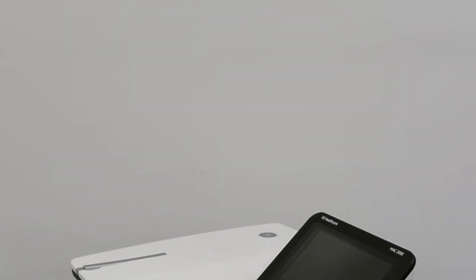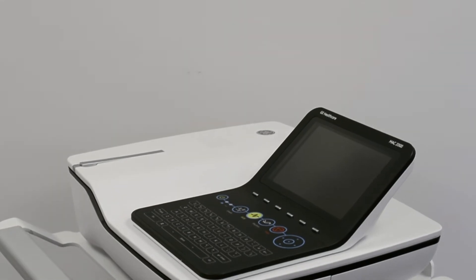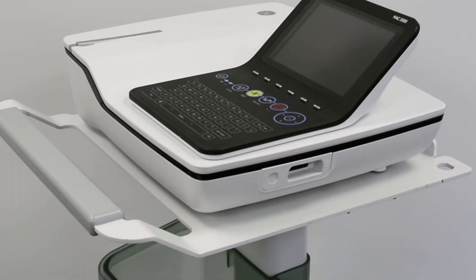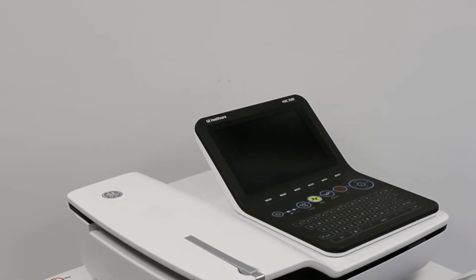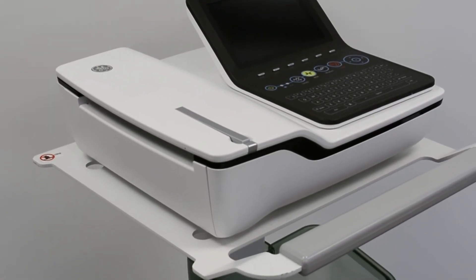the refurbished GE MAC2000 EKG machine up to 50% below the cost of new, with the same service and warranty contracts from the manufacturer. Soma not only offers EKG machines and ECG systems, but also a wide variety of capital medical equipment including medical parts and accessories.